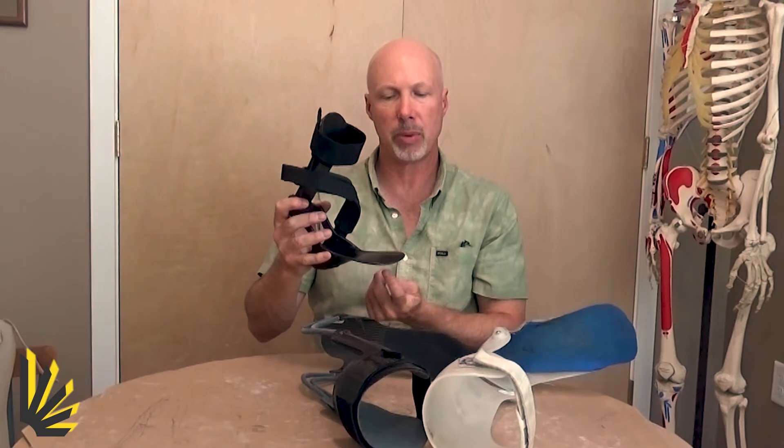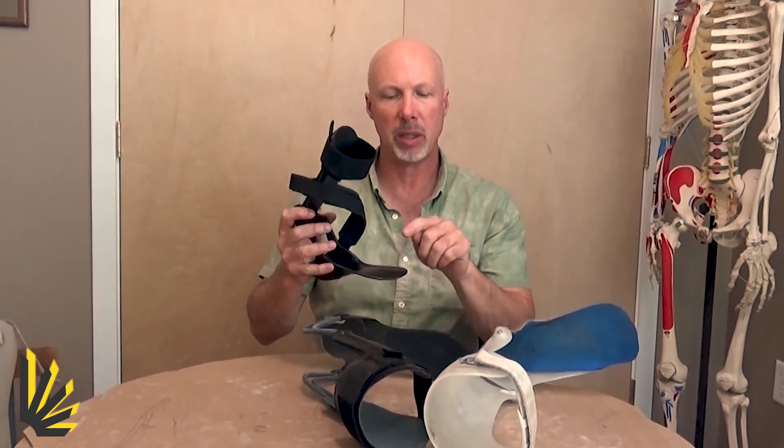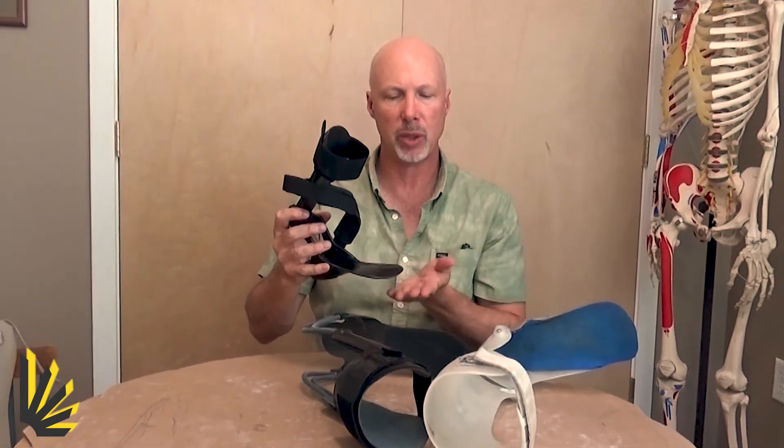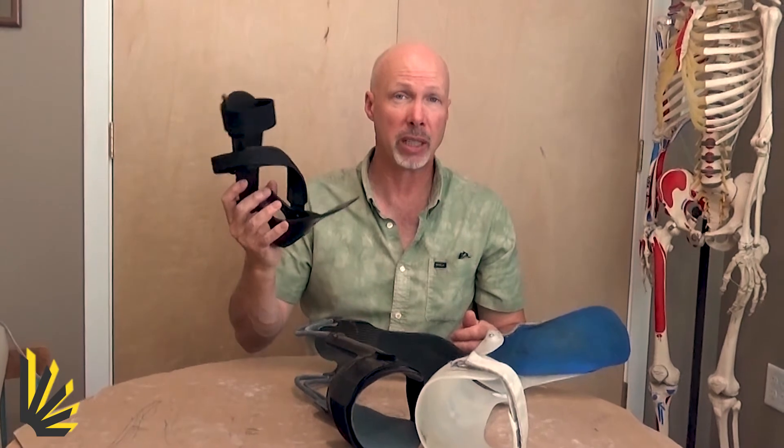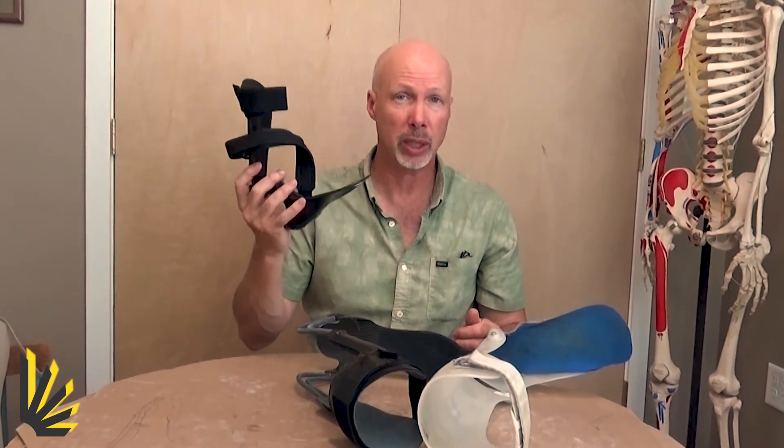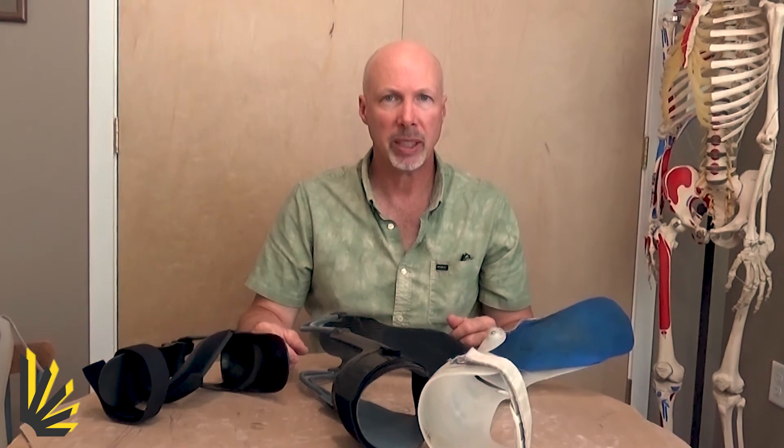In a sense, the brace lifts the middle of the foot, and then the middle of the foot lifts the shoe, and then the shoe is recruited and provides the lift for the toes. So this turns out to be a more effective and comfortable solution than the full-length footplates.